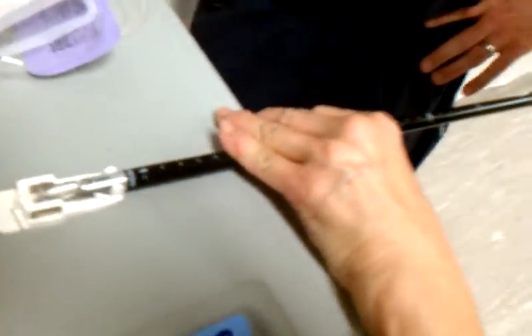Squeeze the handle. Squeeze the handle. So all the instructions are here. Keep holding this handle. See, now you let go. Keep going.